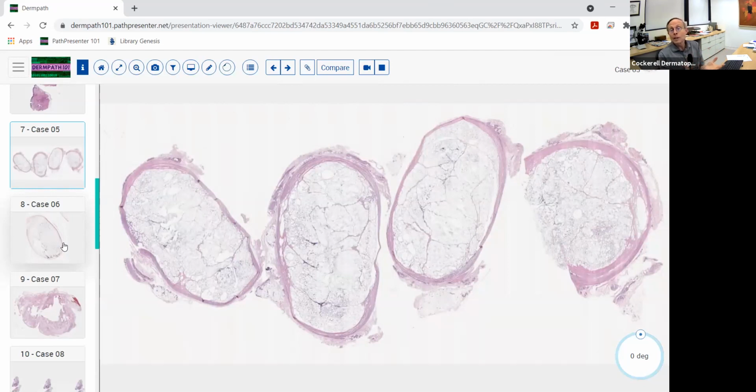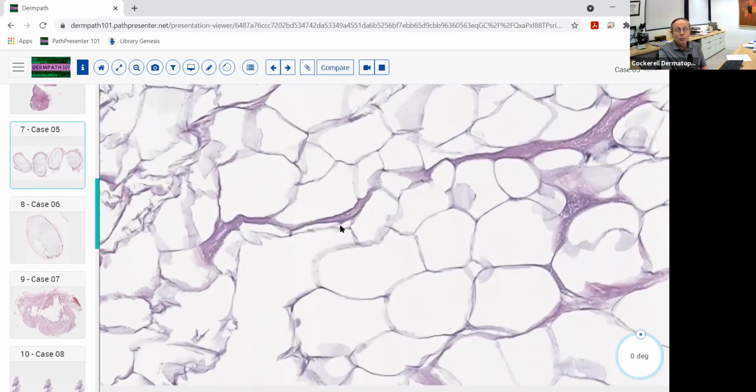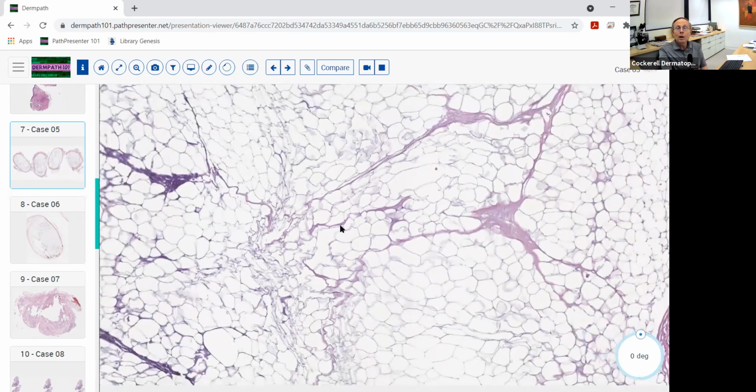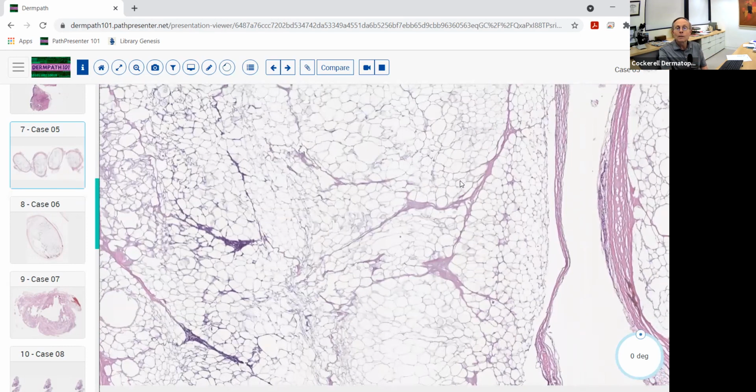And the first one of these you can see here is an example of a lipoma. Now, this is kind of an interesting variant of a lipoma. Notice that this might be actually one lesion that they just cut in kind of a bread loaf fashion. But you can see that it's a relatively small, symmetrical, well-circumscribed lesion comprised of normal fat here. These are normal lipocytes, nothing atypical about them at all, but it's kind of got this fibrous capsule to it that you can see here.